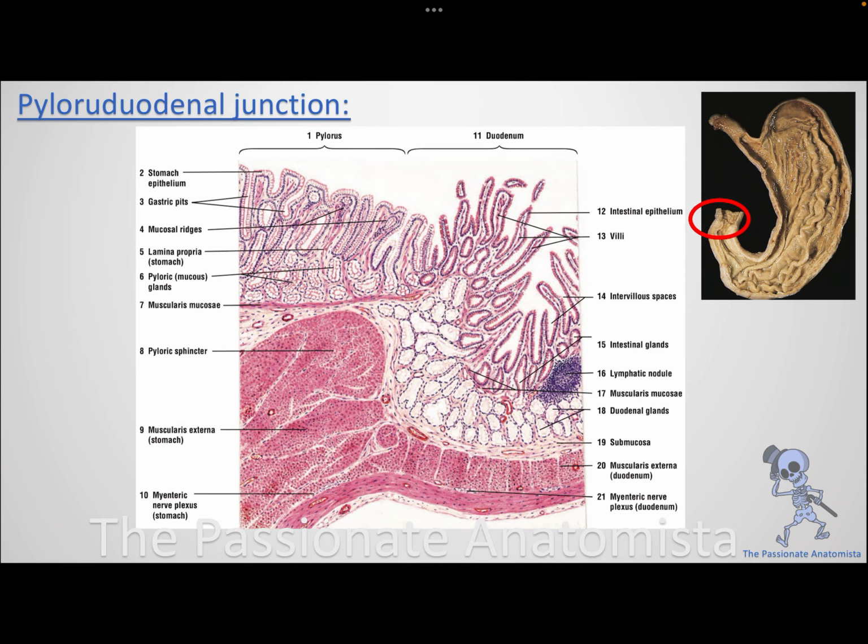So this is another picture. We talked about the stomach, and now we are moving on to the pyloroduodenal junction. After the lining epithelium of the stomach, we're going to see another important folding of the mucosa itself with a core of lamina propria, and this is the villi. Once the epithelium changes from just submucosal foldings to submucosal and mucosal, you get the villi, finger-like projections.